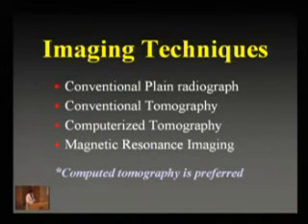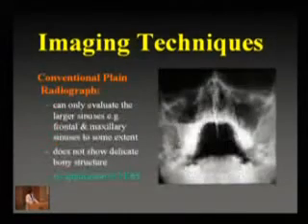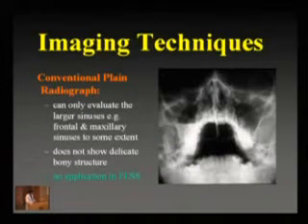If you look at the available techniques nowadays, we can have plain radiography to MRI perhaps. But among these, I think the CT is the one preferred by most FESS surgeons for a number of reasons. The traditional technique with plain X-rays actually has no application in FESS nowadays because it doesn't show the delicate bony structure very well, and there's a lot of overlap. In the skull itself, in the sinuses, whether you look at it one way or the other, there's a lot of overlap, unless we can see the structures in tissue planes.